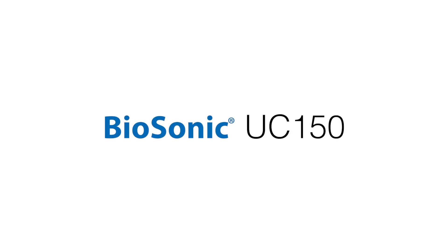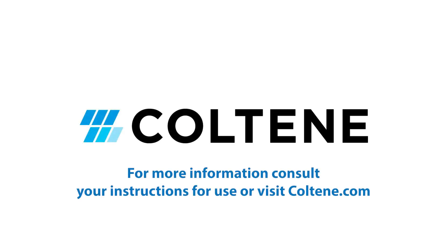Your Biosonic UC150 is now set up and ready to use. For more information on your UC150, consult your instructions for use or visit Coltene.com.